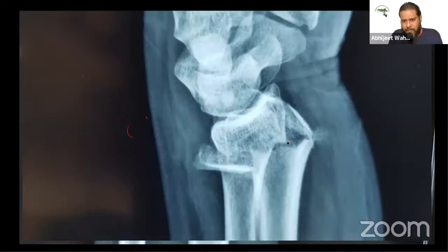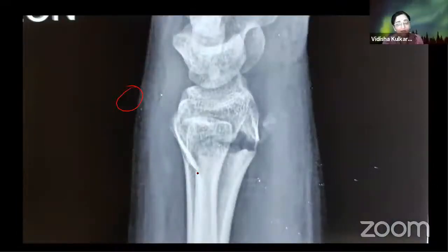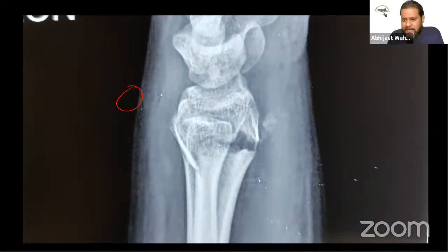So at this stage, what would be your modality or choice of fixation of this fracture? As this is an unstable fracture, though it is aligned well with the traction view, I will go for internal fixation with a volar plate and fix all the columns with screws and intraoperatively check the stability. If there is any dorsal jetting or ulna ballottement positive, then I will fix the ulnar styloid with suture anchor. Okay. Anyone else from the panel? Jindal sir, Bhatia sir? I agree with Vidisha. We'll go ahead with the internal fixation. I'll put a volar plate.